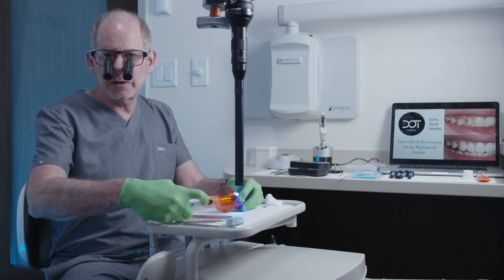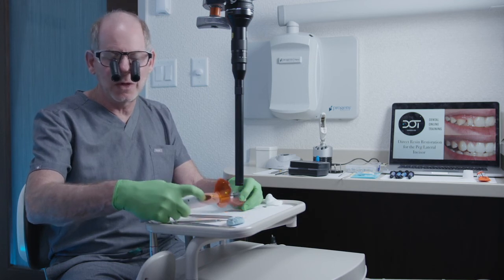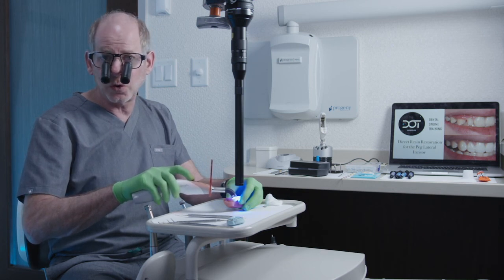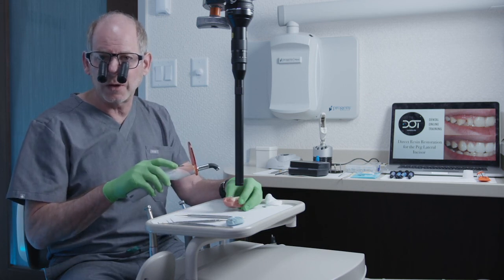Your turn. This takes a little bit of time — it's actually much harder on these plastic models than it is in the mouth. Take a little time. Make sure you're supporting that metal matrix. Do an initial cure. Then gently take off the matrix band from the palatal and from the facial, once you've smoothed off all those margins.